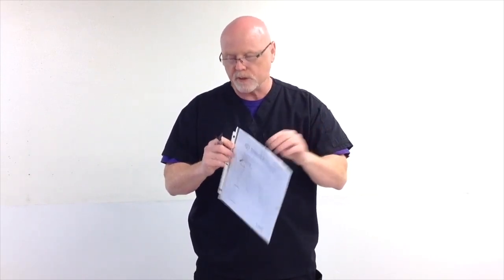Once we determined that, we've gone through, read the entire S-bar, made our decisions. We're going to click that box, show it to the CE, and then they're going to give you the head nod, and then we're going to go ahead and go through the process of setting our table up to perform this intermittent cath.